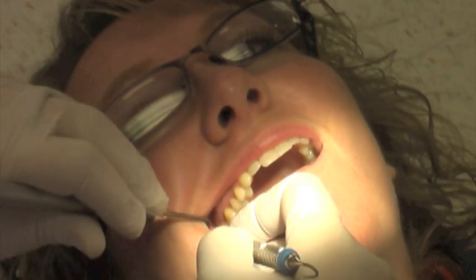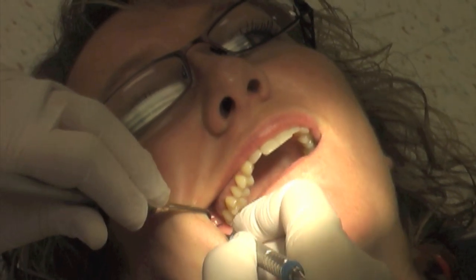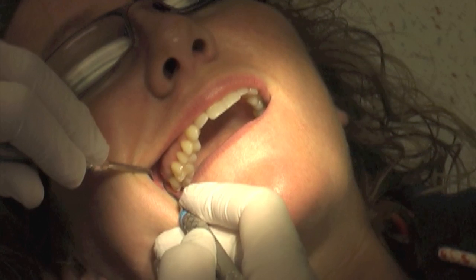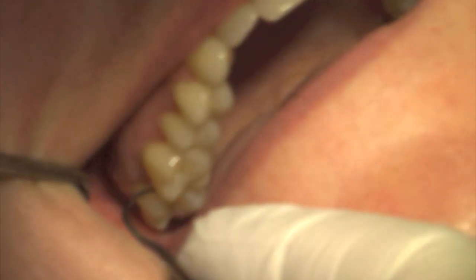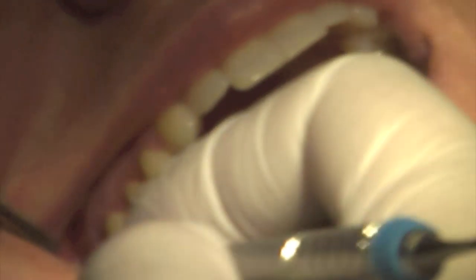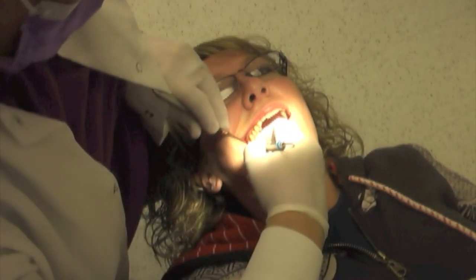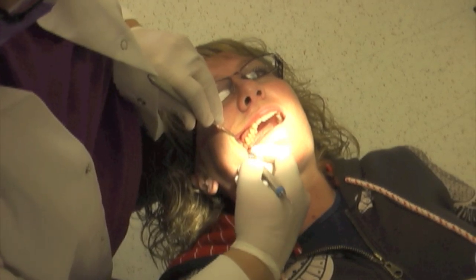For the posterior teeth, 8 o'clock is more comfortable to gain access to the back molars. Fulcrum extraorally — and we'll talk about that. You can come toward the tooth laterally, and when you get to the mesial, go laterally again. This position allows you better access. If you're sitting at 11 o'clock and you're trying to get in there, you really have to alter your body positioning to get that lateral pressure, so that's a lot harder to do.